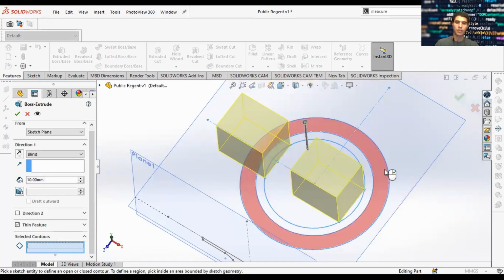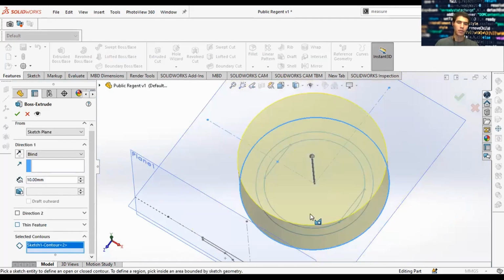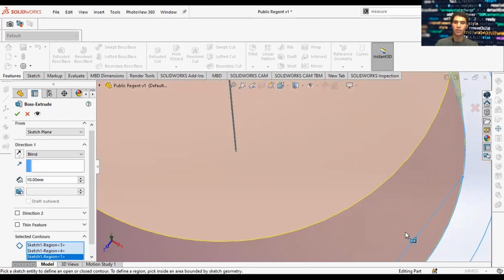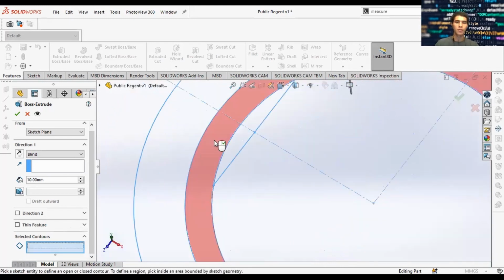So I'll go ahead and click your selection so that you can see. This would show the contour of everything within this circle. Delete this, and I want to select this contour. Now it's everything within that circle. But if I want to click a region, I need to click inside that region particularly. See? So these three regions make up the same contour of that circle. Okay.